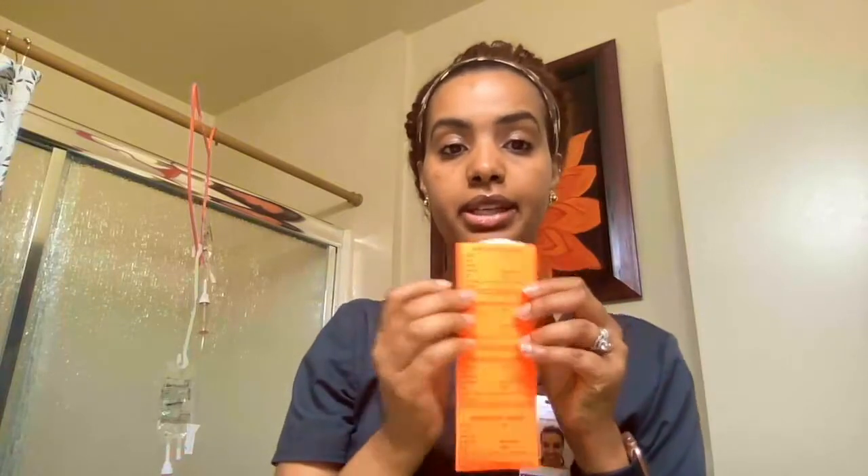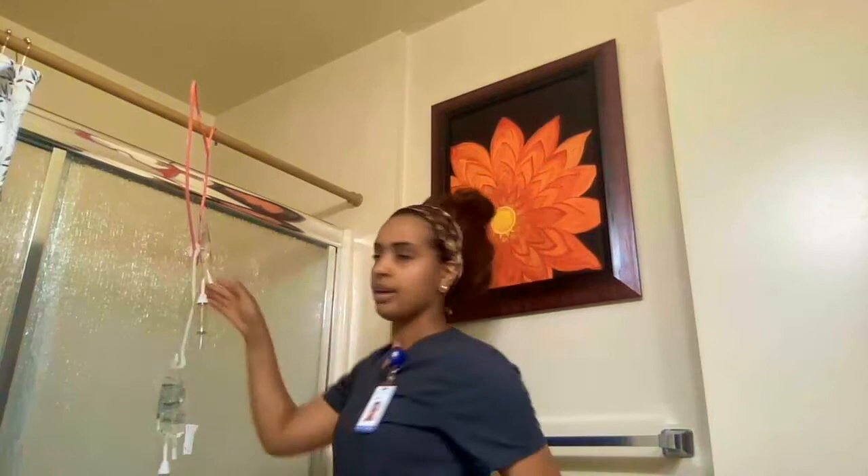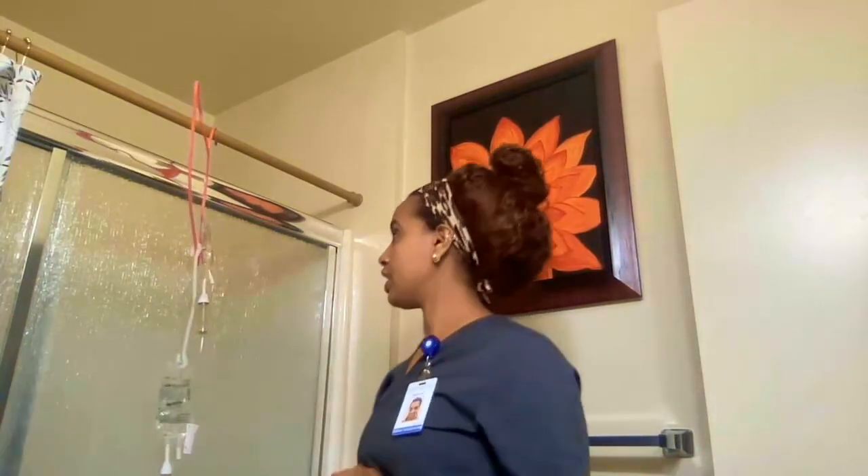The last thing I need to do is fill out the medication label. It asks for the patient name, the drug, the room number, the amount added, the fluid, and the start time. I'll fill in all the patient information and place the label on the bag containing the medication that has been added. That is how we do IV fluid and medication administration. After completing this, I will wash my hands and document everything. Thank you so much.